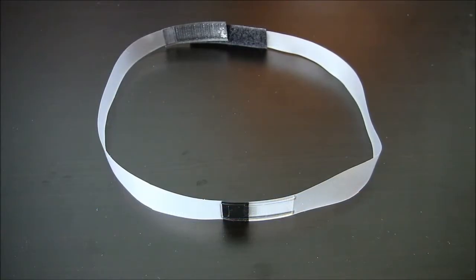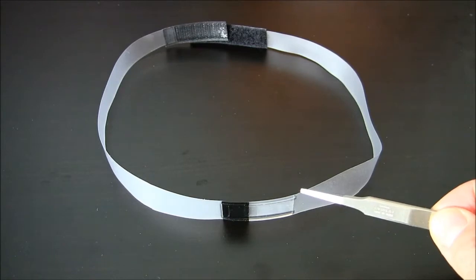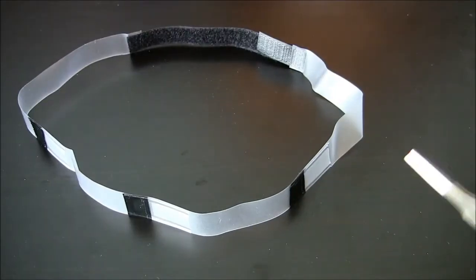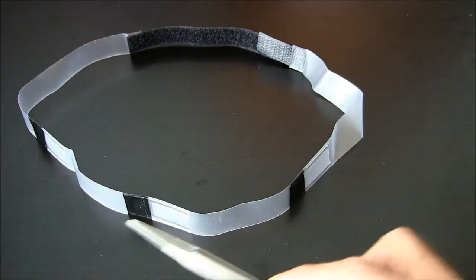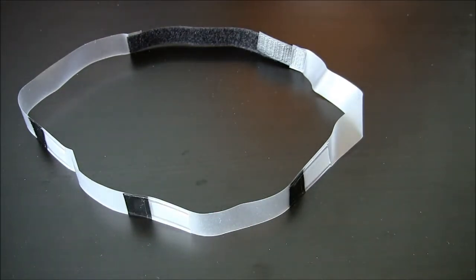There are two main styles of headband. The first style has one pocket as seen here. The second style has three pockets as shown by these areas with the black markings, although a two-pocket style is also available.